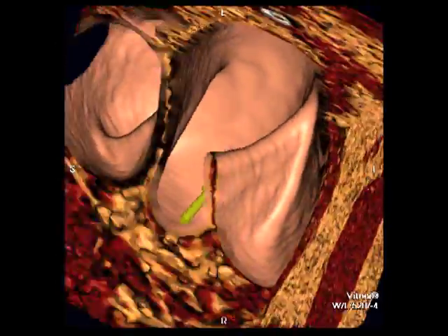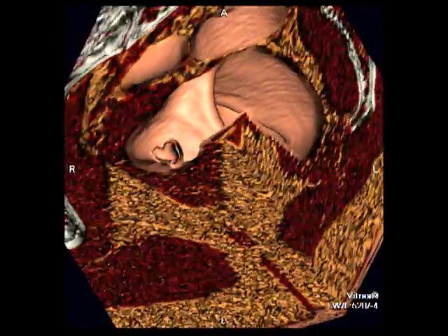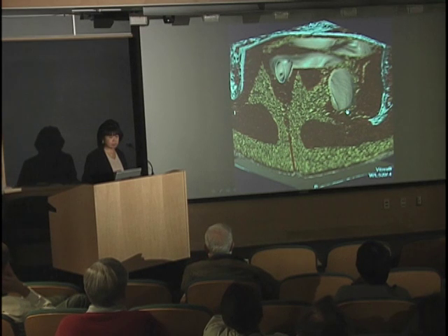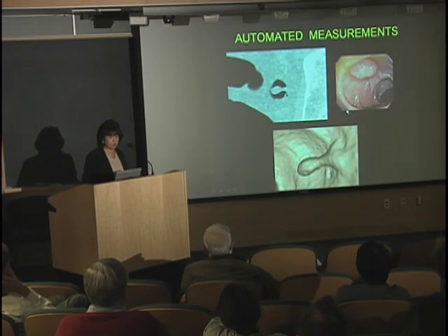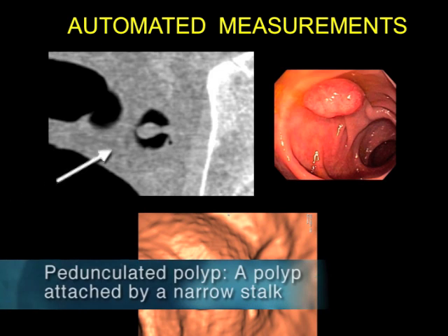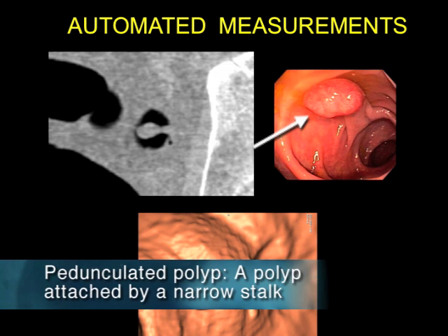We measure the size of the polyp really easily. This is another polyp — a pedunculated polyp — and this is what it looked like on the colonoscopy. If we do find a large enough lesion, we will send the patient on to the traditional colonoscopy to get it taken out.